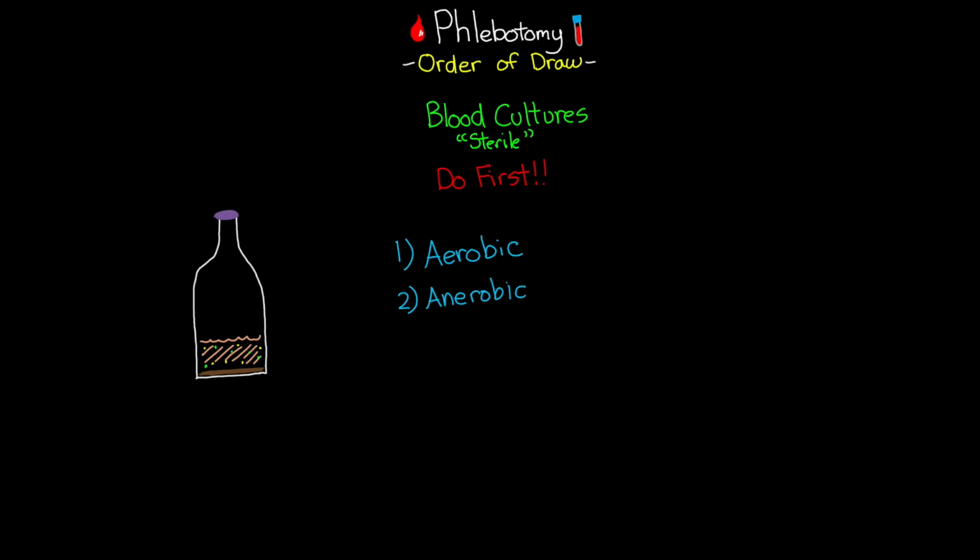And so really the last thing that I'm going to talk about with the blood culture bottles is, again, going back to the basics of this, it's really important that you maintain that sterility, because this truly can affect or have an impact on the treatment that your patient receives.